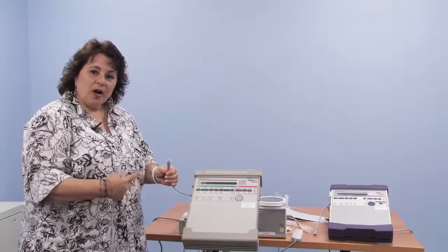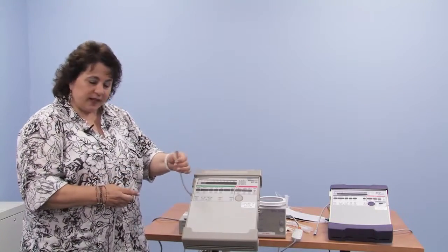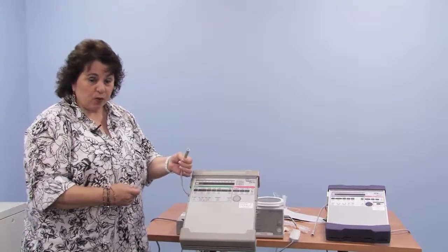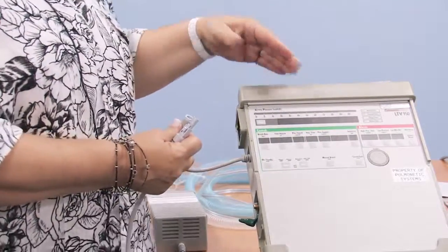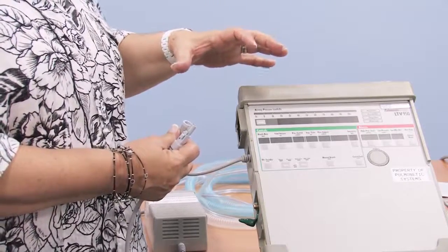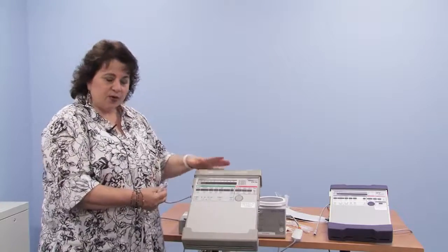With regard to electrical power for the ventilator, we spoke about this being the adapter on the ventilator in which it receives power to run. It does have that 1 hour battery in it, although the company recommends that's merely used so that the machine will continue to run when you transfer from one type of power to another.